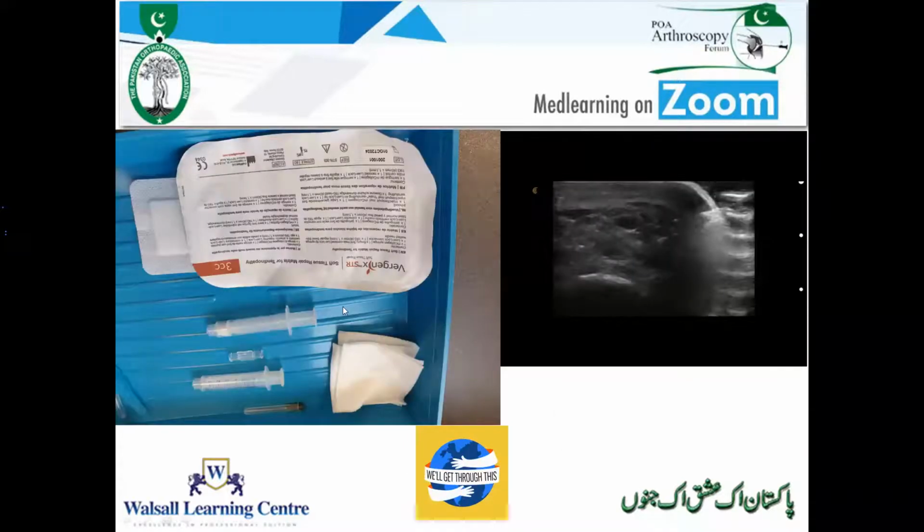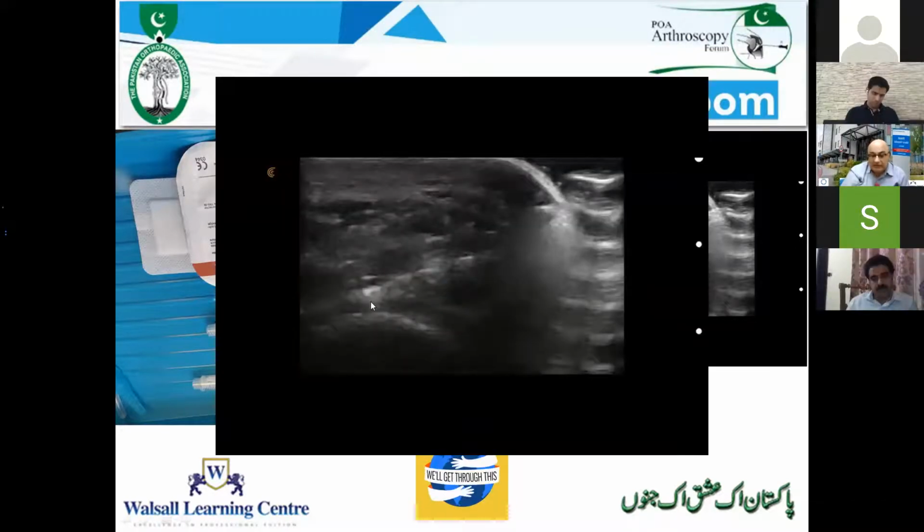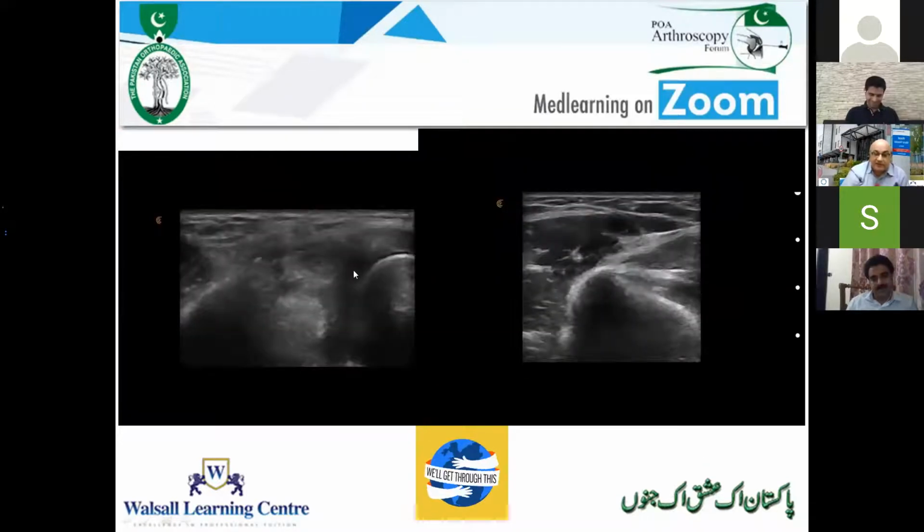Okay, I started doing tendon ACPs, and this is a system. This is a plantar fascia. So you can see the heel and the plantar fascia on an ultrasound. And this is my needle coming into the plantar fascia. As Sufyan says, I'm now an injection king. Now I do a lot of injections out of my comfort zone.